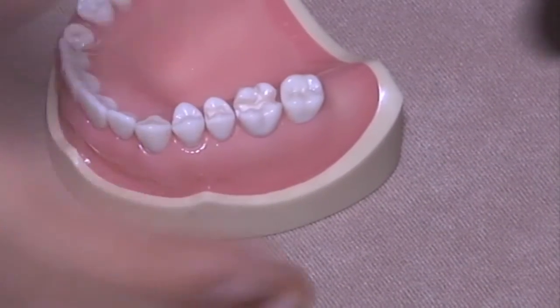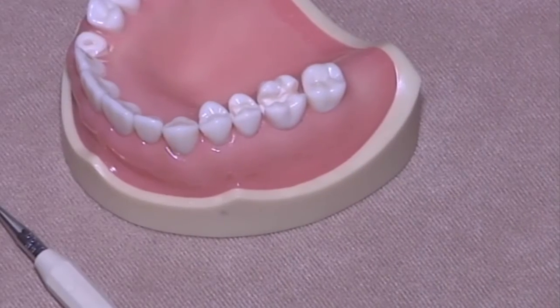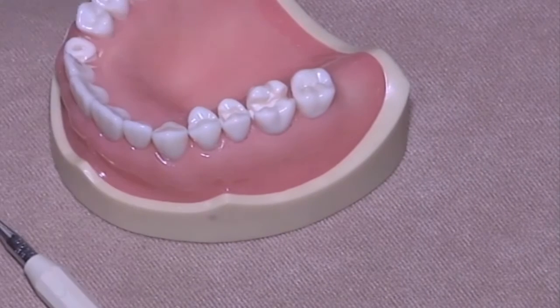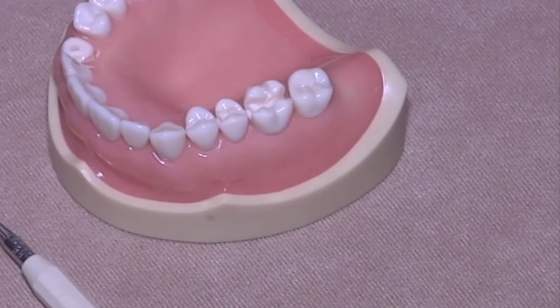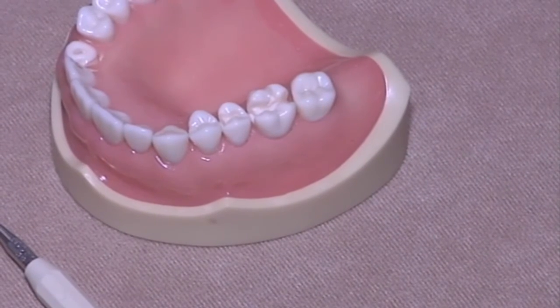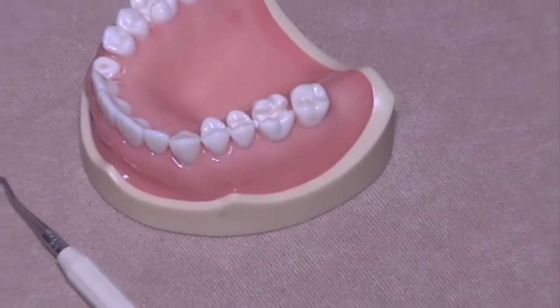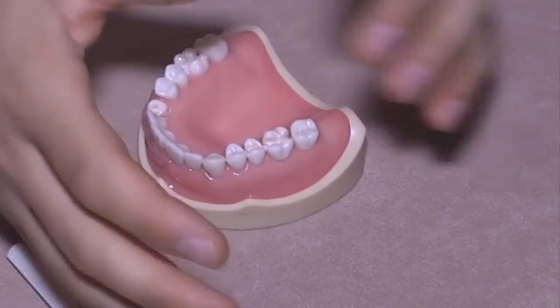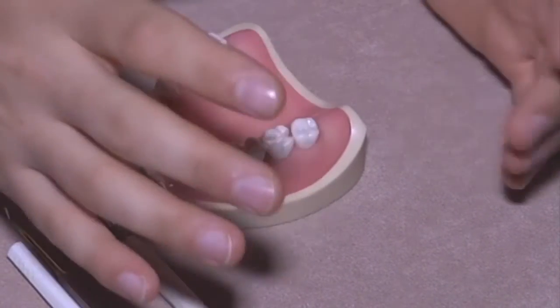There are several reasons for doing that. Contraction stress is lower, and the most difficult part of the restoration, you do it immediately, and then you can think in a positive way during the whole restoration, and then you can manage also the anatomy of the tooth in a proper way.